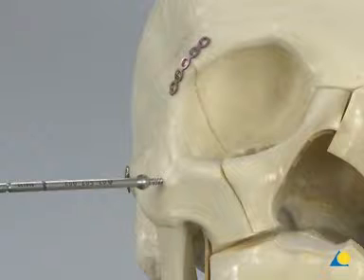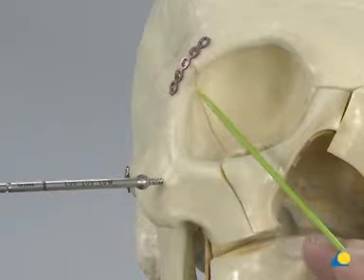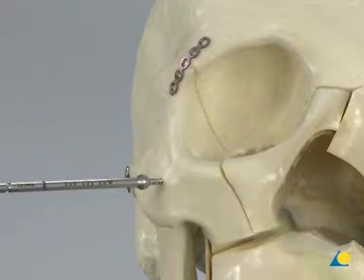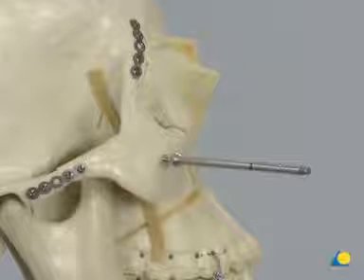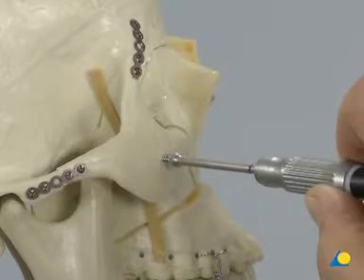The correct three-dimensional reduction of the zygoma is confirmed by an intra-orbital examination of the lateral orbital wall. It is important to ensure there is no step-off between the greater wing of the sphenoid and the zygoma. If the alignment is correct, the remaining screws are placed in both plates. The reduction tool is removed using the screwdriver handle.